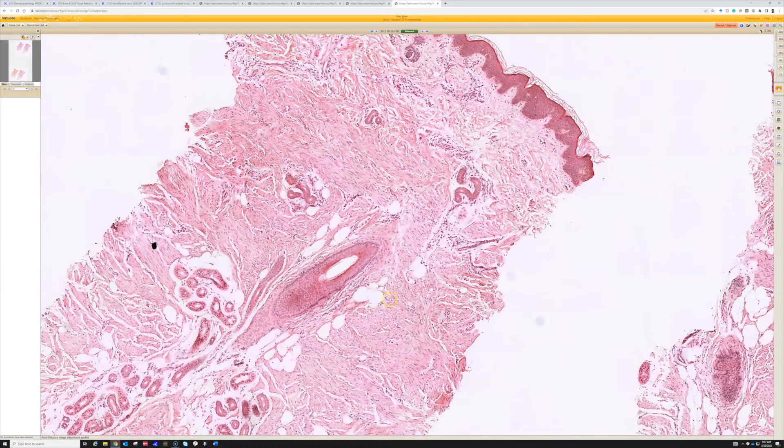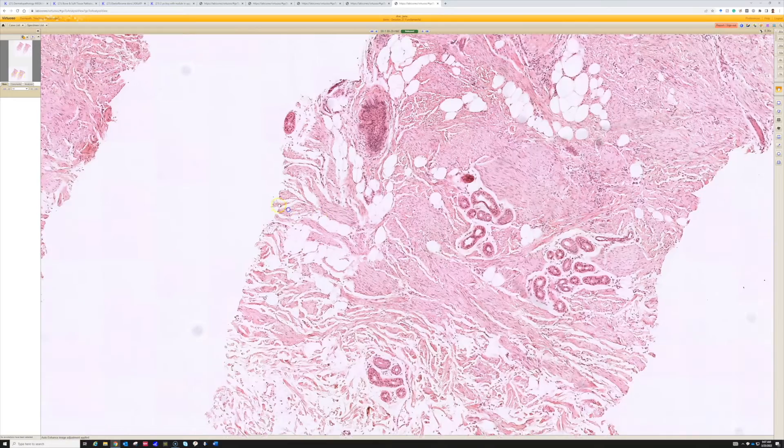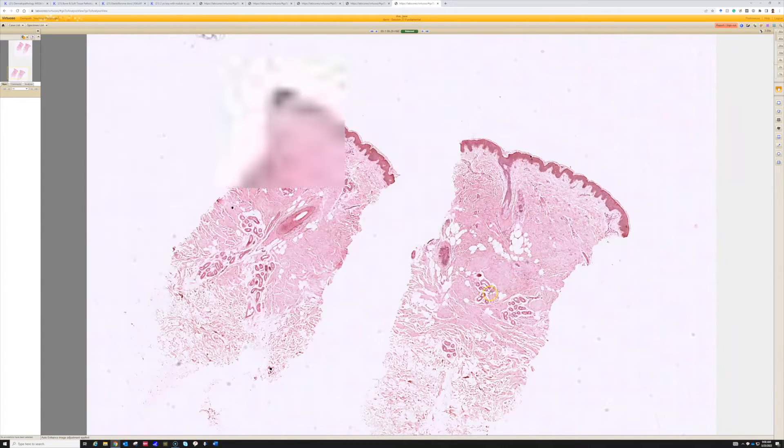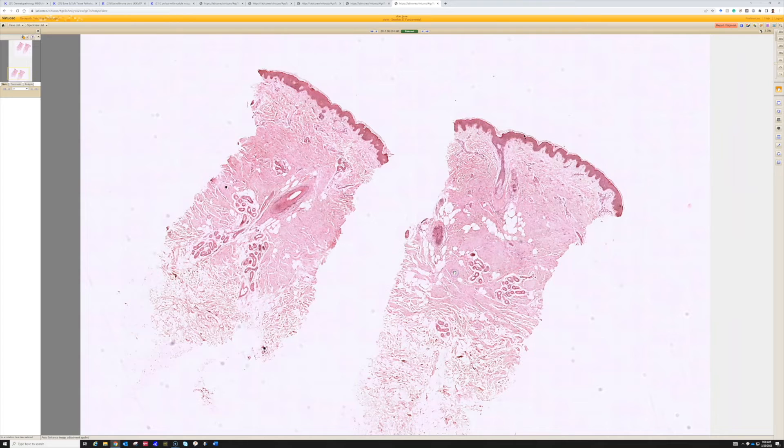But I wanted to bring up fibroblastic connective tissue nevus because it does come in the differential of this sometimes, and it's good to know. So a nice example here of benign dermatomyofibroma, and that's a good example.